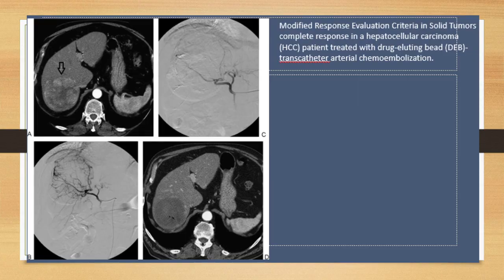Here is another example. This is a good example of what a liver tumor would look like on CT. This is a contrast study because we see the aorta here is nice and bright. We can see this mass here in the liver. So this is liver, spleen, just to orient you. You see this enhancing mass. Here is what it looked like originally on the angio images. You see all these spider web vessels, very similar to the other one, so abnormal. So they went in and did the TACE. You can see those vessels are no longer there. Here's the follow-up CT, same thing with contrast. It's no longer enhancing. This is dead tumor. So it's been treated with the chemo.